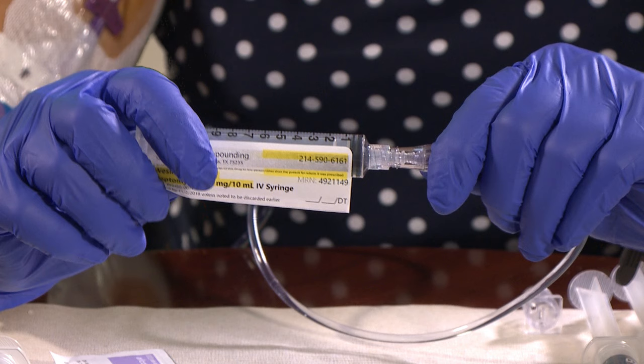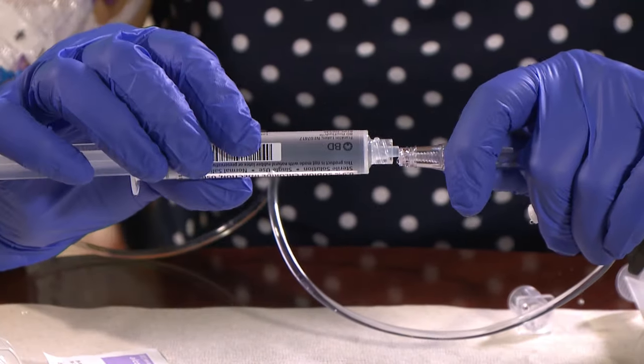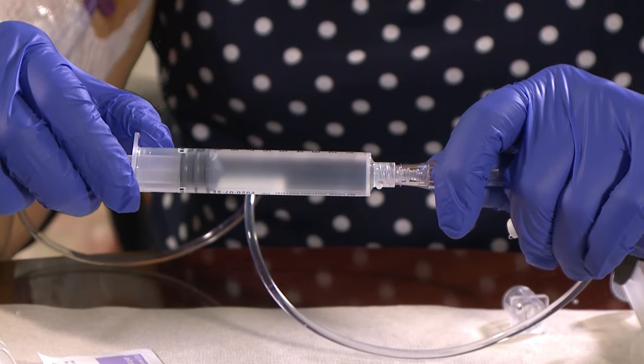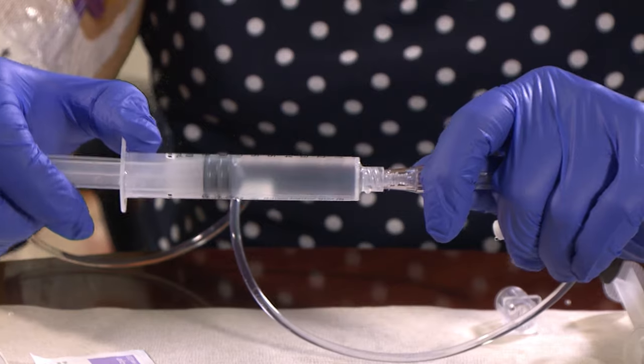After you've finished pushing all the antibiotic from the syringe through your PICC line extension, take your IV antibiotic syringe off your PICC line by untwisting it. Remember, be careful not to touch the tip of your PICC line extension or any of the syringes to anything. Now, repeat the saline flush procedure using two saline flushes as you did before to make sure that all of the medicine is flushed through the PICC line.